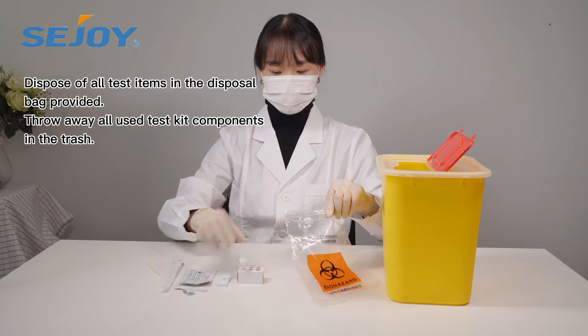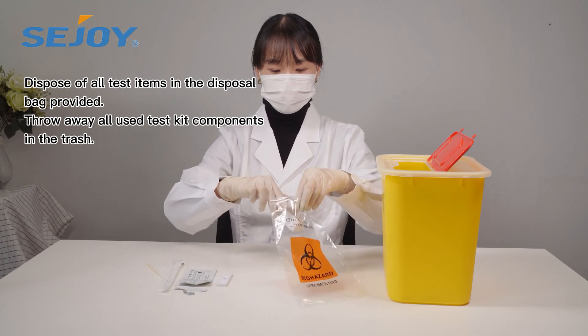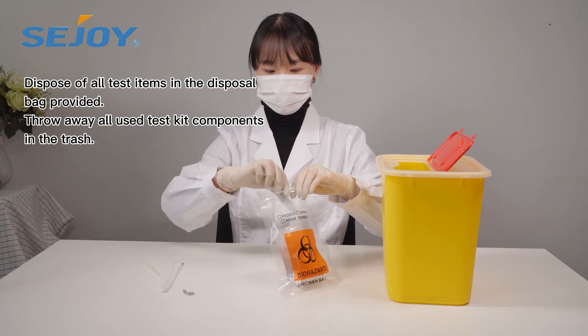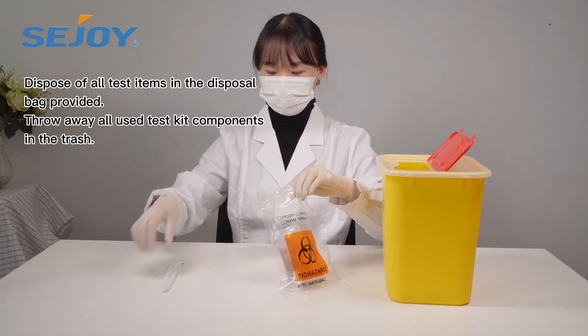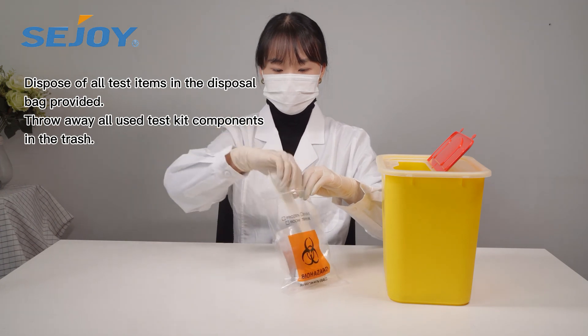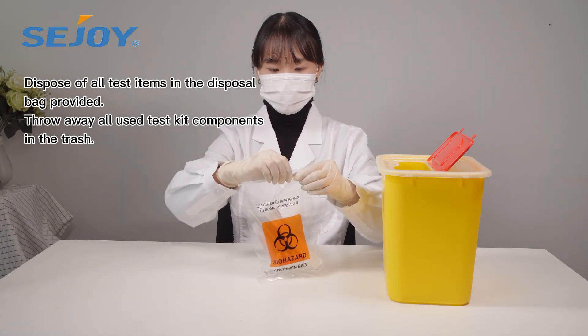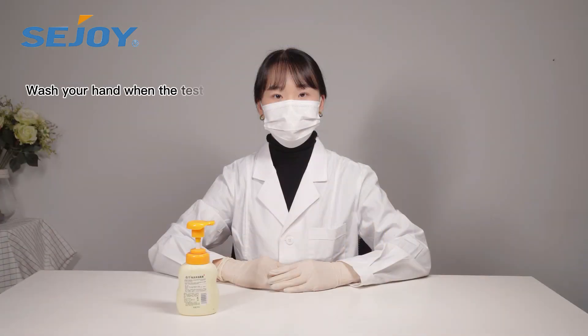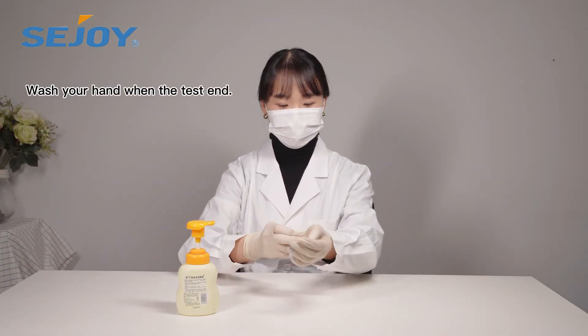Dispose of all test items in the disposal bag provided. Throw away all used test kit components in the trash. Wash your hands when the test is ended.